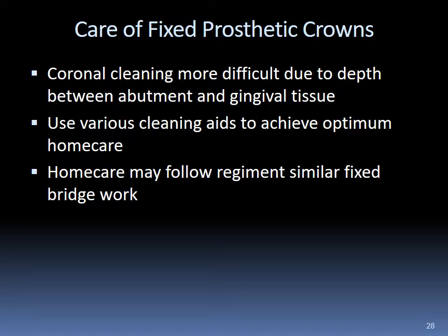Care of fixed prosthetic crowns may be more difficult due to depth between the abutment and gingival tissue. The use of various cleaning aids to achieve optimum home care is recommended and should follow a regimen similar to fixed bridge work.